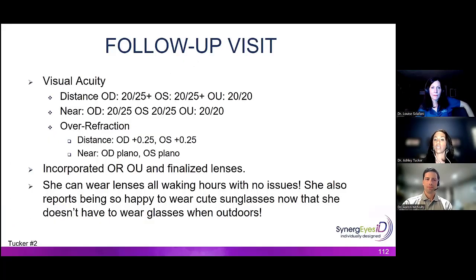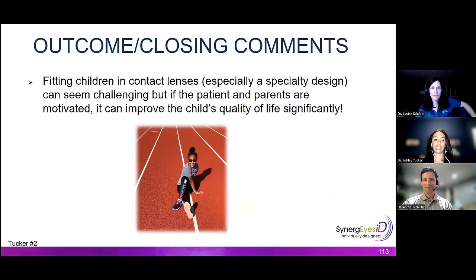So her follow-up visit, again, she was doing really, really good. We ended up with a distance over refraction of +1/4 in each eye. I incorporated that over refraction and finalized the lenses. She's wearing the lenses all waking hours. She is ecstatic that she can wear sunglasses and not have to worry about getting prescription sunglasses. And she's being as athletic as ever with her contact lenses.